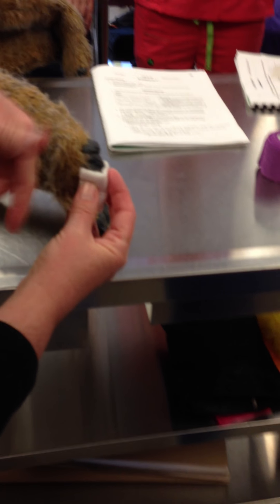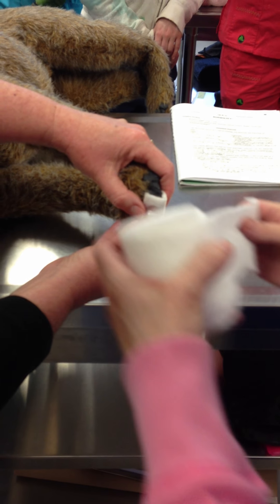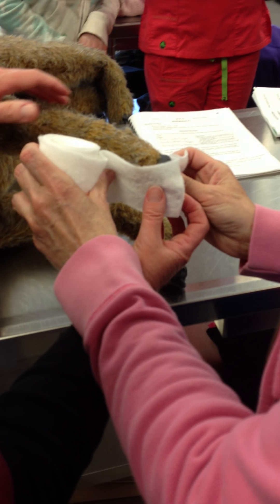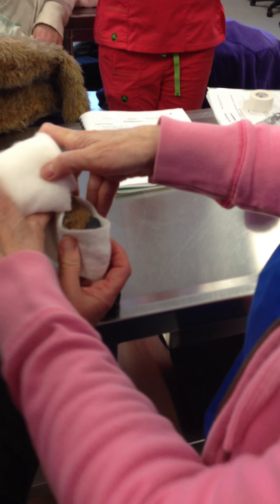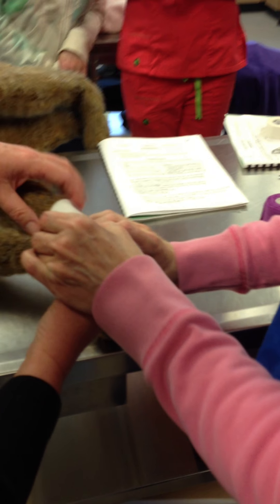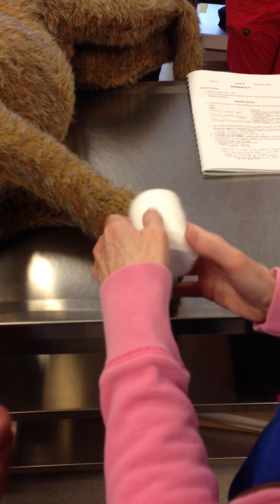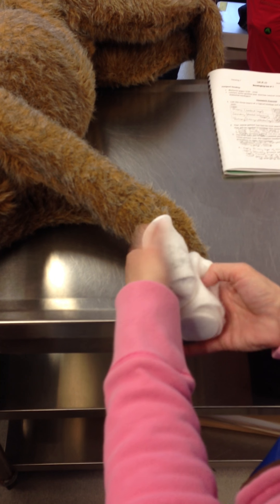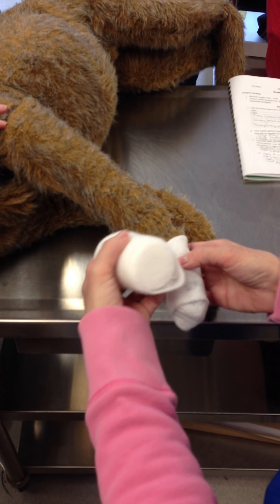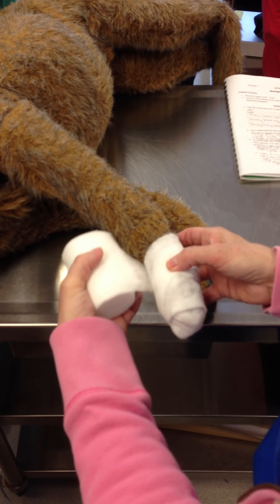Usually what I do is I wrap around the toes first and go up and then do my loop back and forth. So I would want to flip it and then go? Yes, absolutely. So you can do it that way. This way I've got it stuck on and then come around. We're not going to go too far up the leg with this one. I want to aim for the narrow spot to take advantage of the carpus.